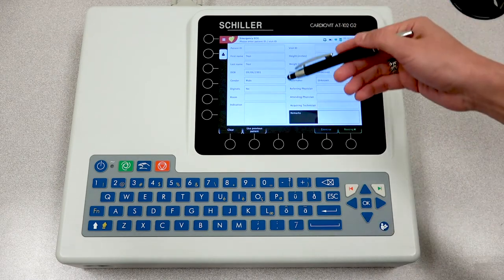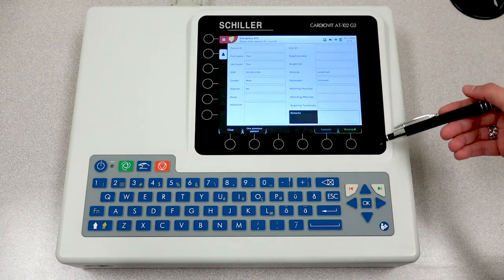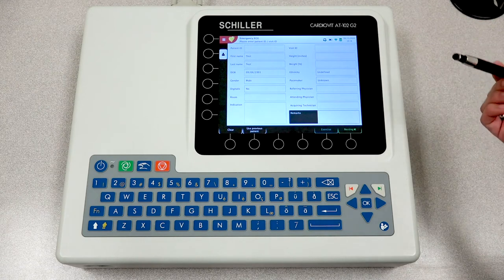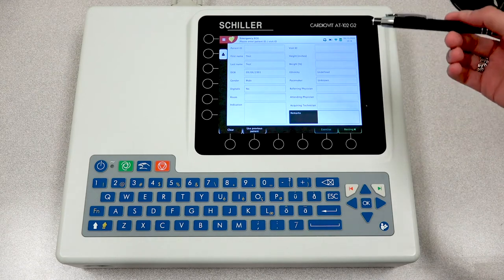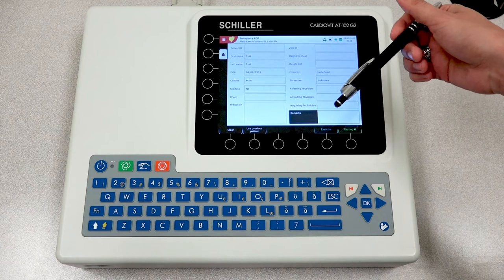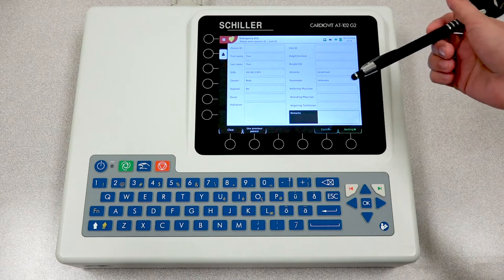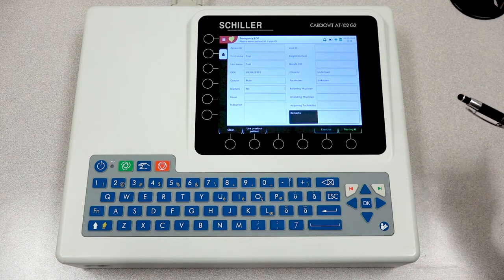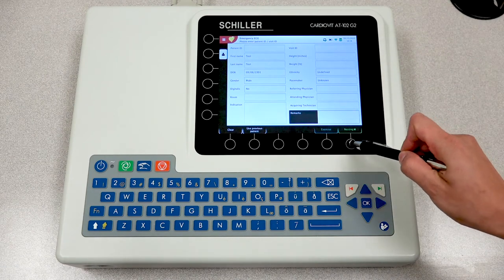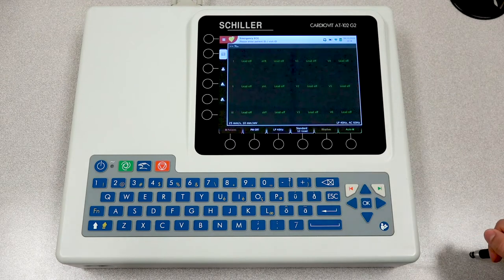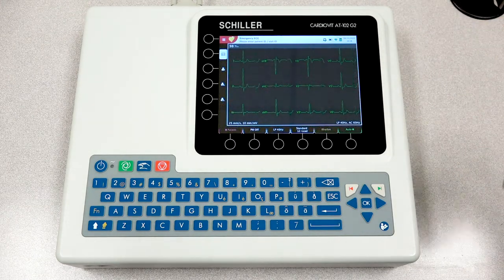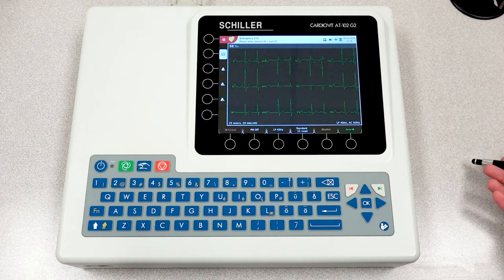Once all your patient information is entered correctly, you can decide whether or not you will do a resting ECG or stress ECG. In this case, let's go ahead and do a resting ECG, so we will select resting. The unit will then go into your waveform screen.